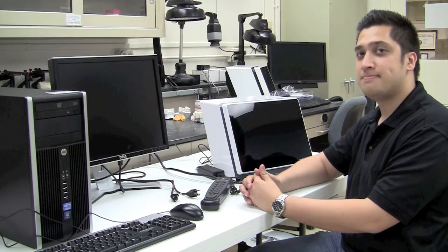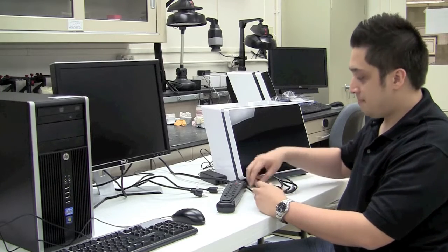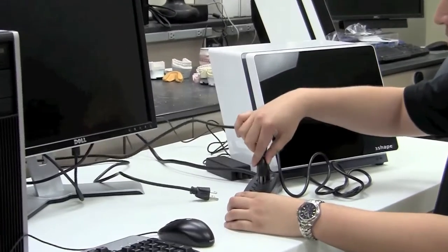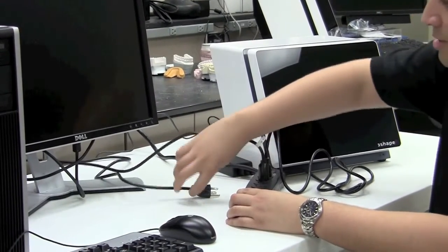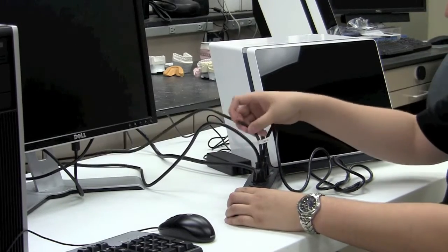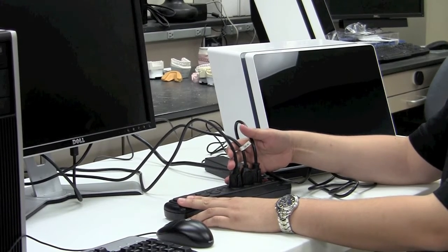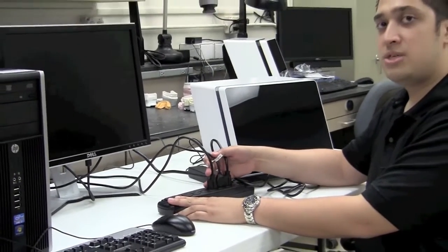Now that you've connected all data connections on the back of the PC tower, the monitor, and the 3Shape scanner, go ahead and start plugging these devices in one by one to a power adapter or surge protector. Alternatively, you can use an uninterruptible power supply or battery backup system to further protect these devices in the event of an unexpected power outage. Typically, I also recommend turning the power switch on the surge protector to the off position. Since it's hard to differentiate one cord from another, it's a good idea to use a label maker in your lab to label each cord depending on which device it's plugged into.